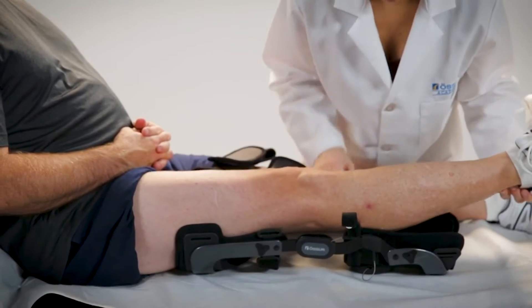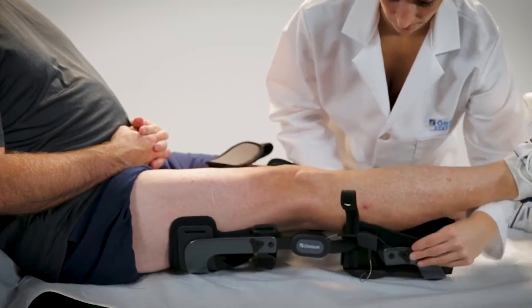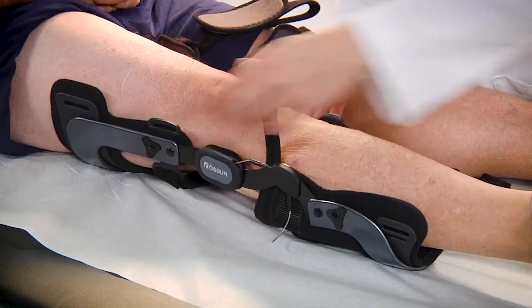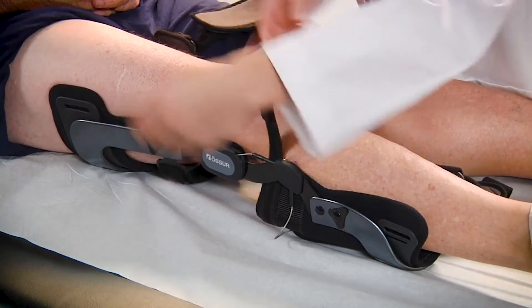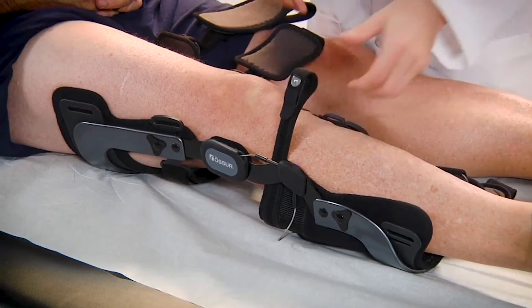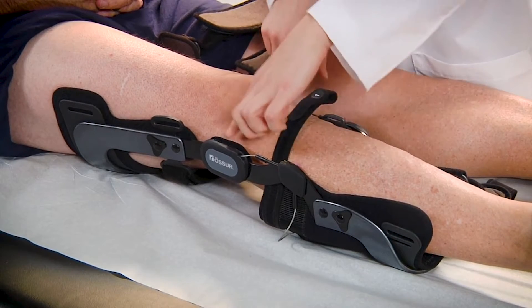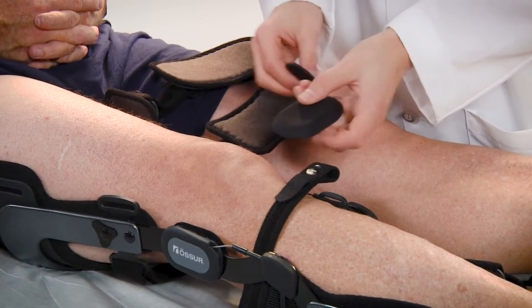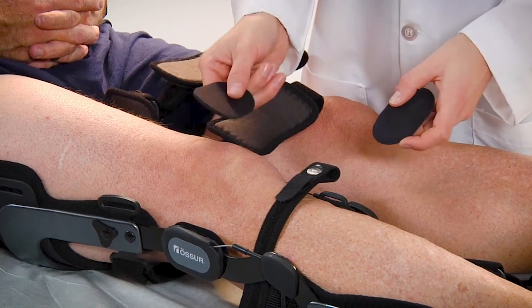Ensure proper alignment of the device on the leg. For height positioning, align the center of the hinges slightly above the middle of the kneecap. For side positioning, the center of the hinges should be at the midline of the leg. The condyle pads should lightly touch the medial and lateral condyles of the knee.